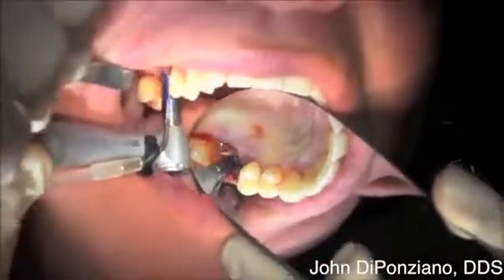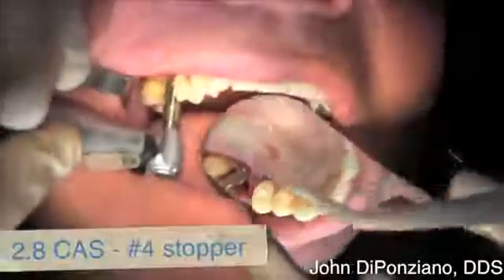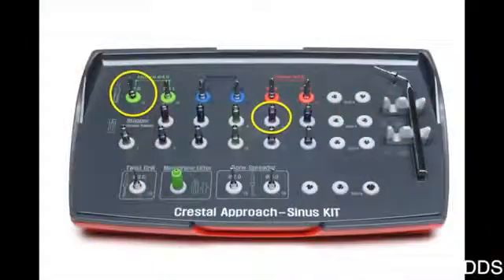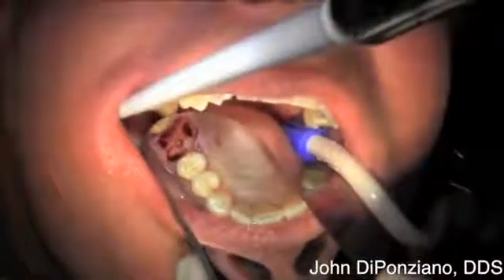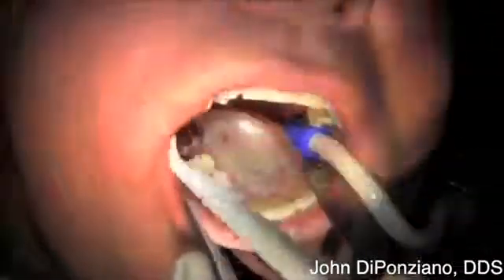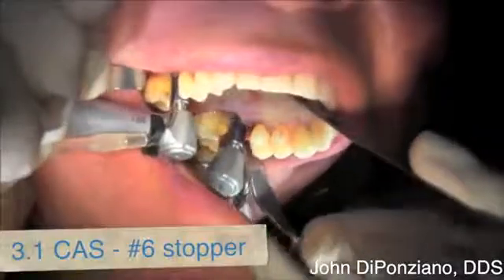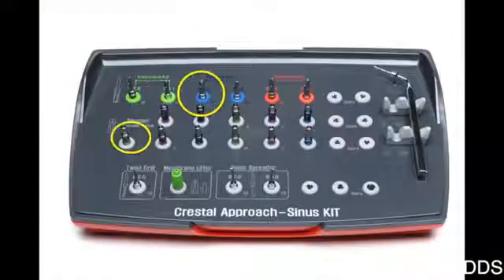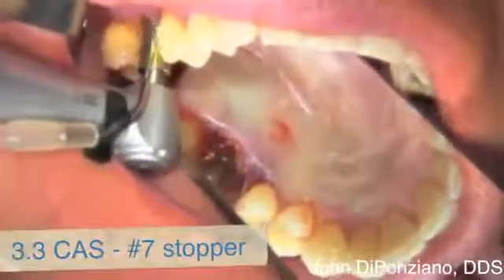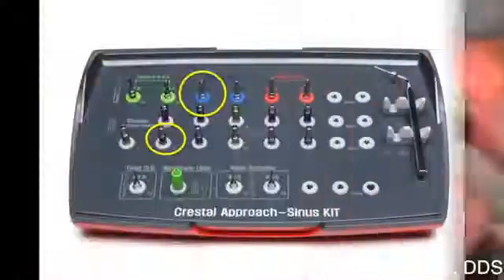We slowly progress up to the next size, one millimeter at a time — the number four stopper with the same 2.8, then the number five stopper with the 2.8. You can see there's still bone there. Now we go to the 3.1 CAS drill with the number six stopper to enlarge the osteotomy and go one millimeter deeper. Then the 3.3 with the seven millimeter stopper, just enlarging slowly and progressing one millimeter towards the sinus.